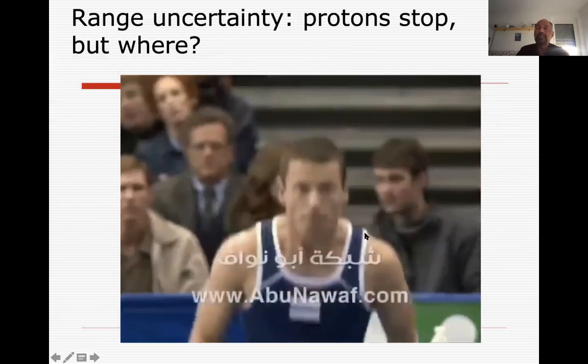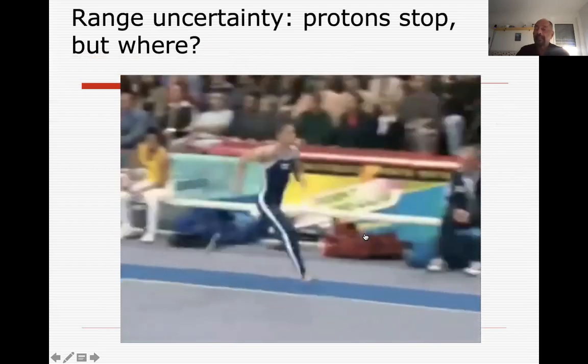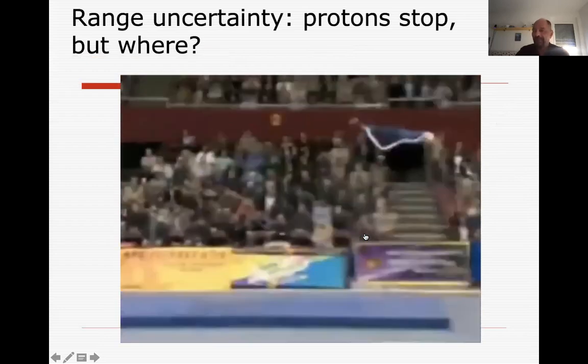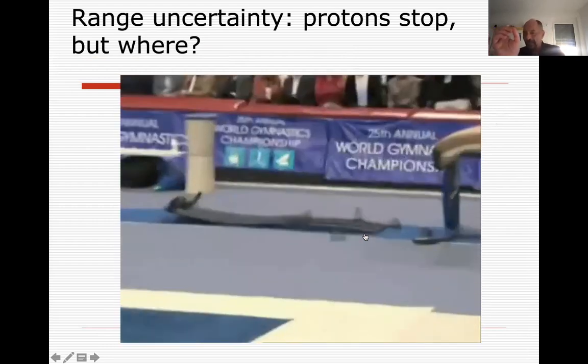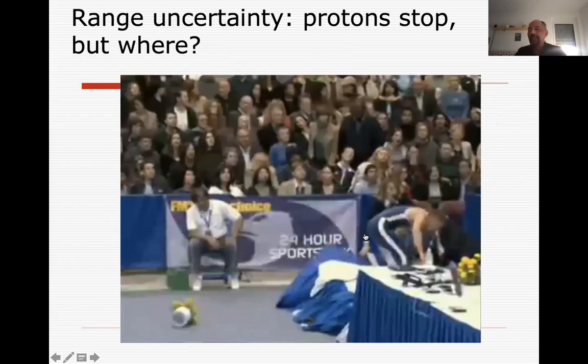But the problem is that we don't know exactly where they stop. And then you have this risk. Particle therapy is all a matter of precision. If you make a mistake, you can have this kind of disaster, which you should try to avoid in particle therapy.